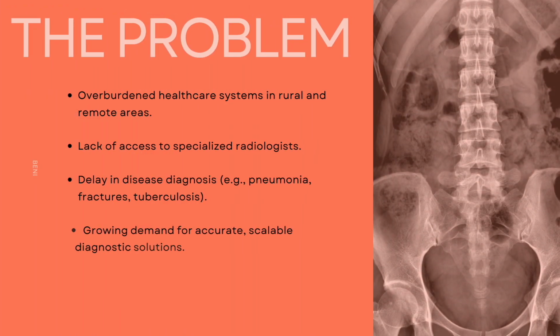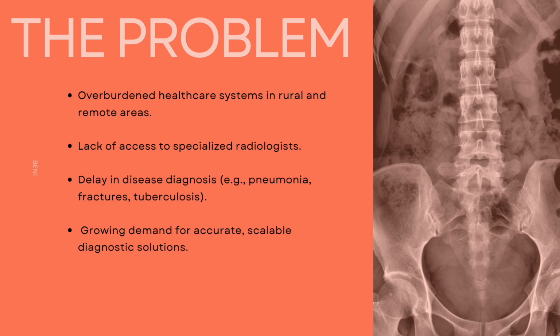Here's the problem that we are trying to solve with VitalScans. Millions of people, especially in rural areas, don't have access to proper diagnostic tools. Even when they do, processes can take days or even weeks. This delay in diagnosis can make conditions even worse and lead to higher treatment costs in emergencies. This lack of quick diagnostic tools can be the difference between life and death. VitalScans aims to solve this by making diagnostics faster and more accessible and reliable.